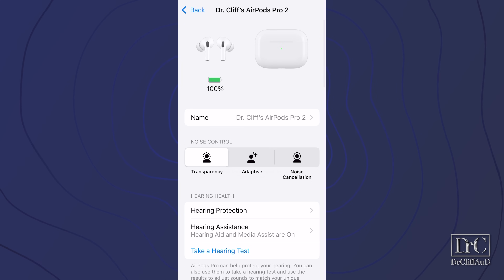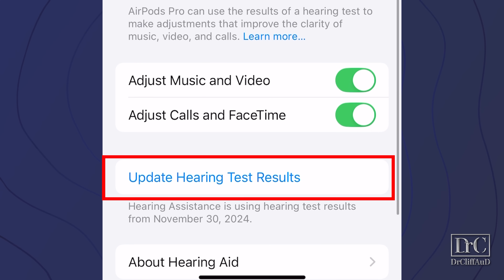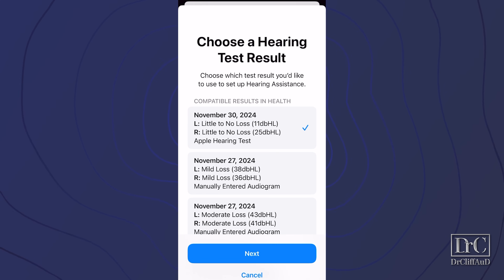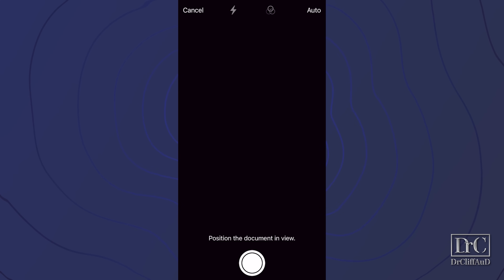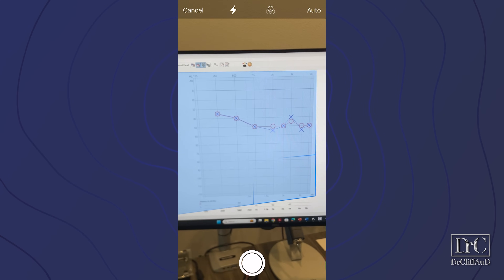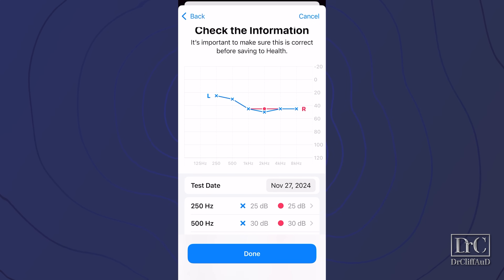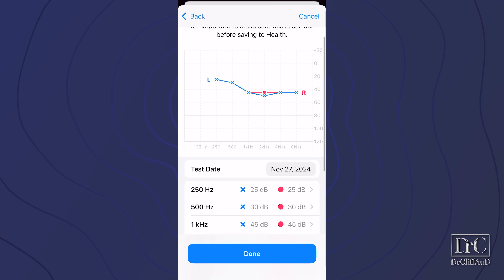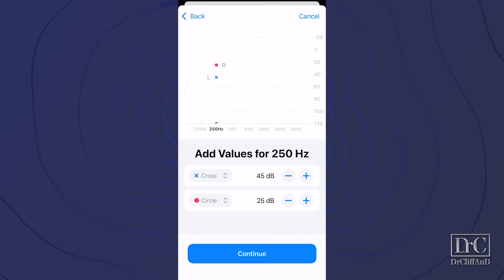To use your results from a professional audiogram, click on hearing assistance, then scroll down and click on update hearing test results. Here you can select other hearing tests you've taken through the app or entered manually previously, since Apple has had a hearing aid-like feature for several years. Or you can click on add hearing test result, where you can click scan with camera or add manually. Scanning with the iPhone camera works better with paper audiogram results than scanning from a computer screen, and you will probably have to go in and correct some thresholds manually. If you click on add manually, you can add an audiogram from photos or files, or enter the results of your professional audiogram by hand.